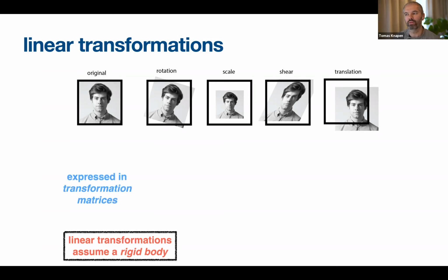So this type of transformation of an image, and to be clear, I'm using a 2D image as an example here, but the fMRI images are 3D, but the same logic holds.